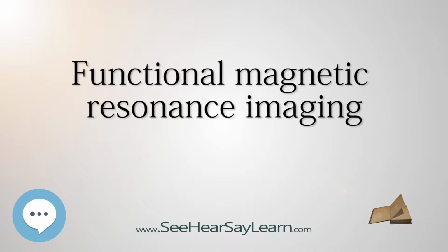Finally, a radio frequency (RF) pulse is played to kick the nuclei to higher magnetization levels, with the effect now depending on where they are located. When the RF field is removed, the nuclei go back to their original states, and the energy they emit is measured with a coil to recreate the positions of the nuclei. MRI thus provides a static structural view of brain matter.